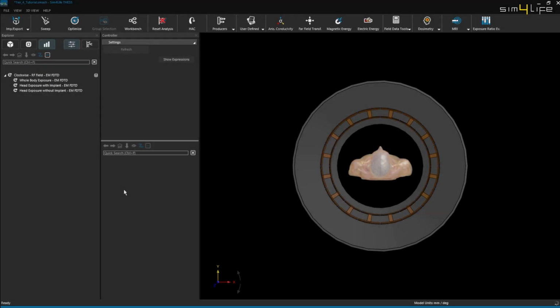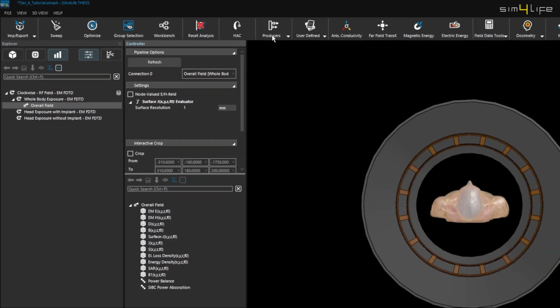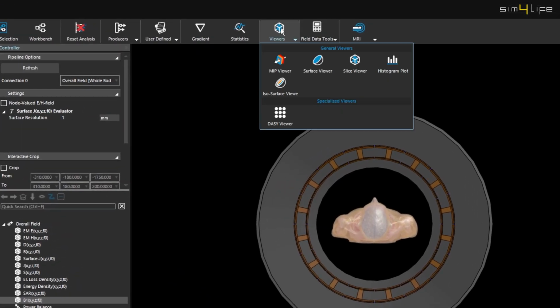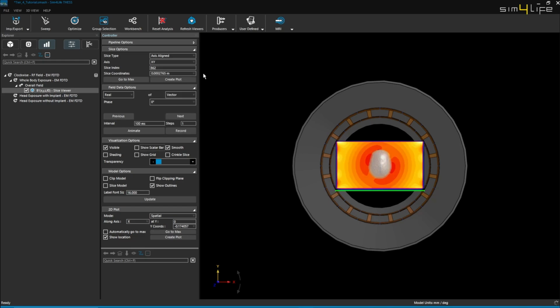To calculate the B1 plus field at the isocenter, select the whole body exposure simulation. Navigate to overall field, then sensor extractor, and finally, B1 field. In the ribbon, select viewer and then slice viewer. In the controller window, under slice options, navigate to the XY plane at the isocenter.